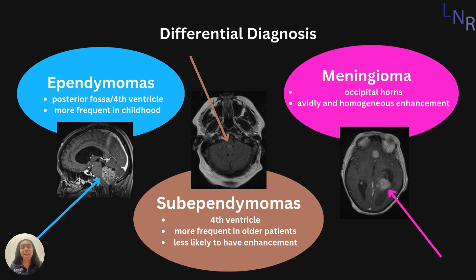Lastly, we have meningiomas, which are usually found in the occipital horns, and they are usually seen with homogeneous enhancement. We have an example of a meningioma in this highlighter pink color.